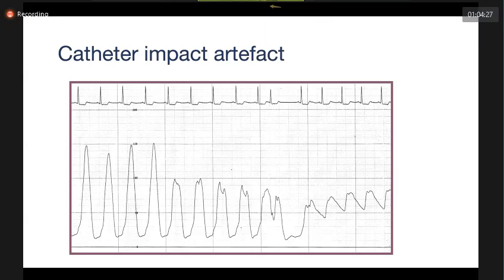The catheter will go on to entrap in the hypertrophied myocardium here, and you will get a pressure wave which is very high and has this kind of contour with a spike, and you will falsely read that as a left ventricular pressure. And if you have a femoral artery or ascending aortic pressure like this, then you will spuriously think that there is a high gradient and you tend to dilate that.